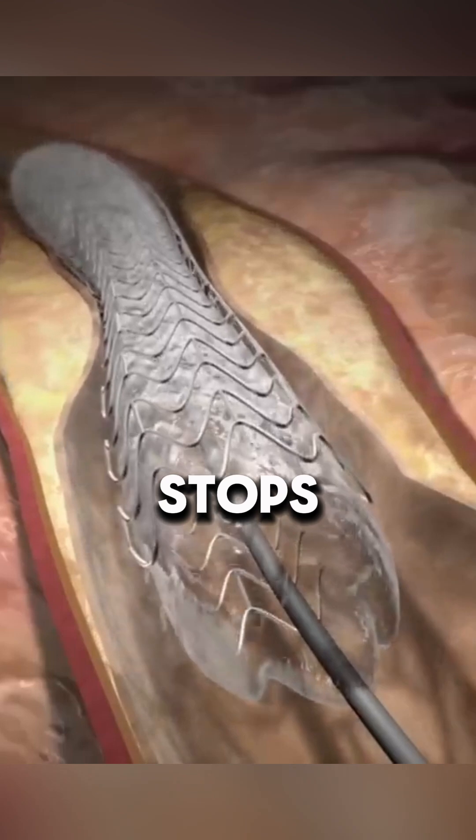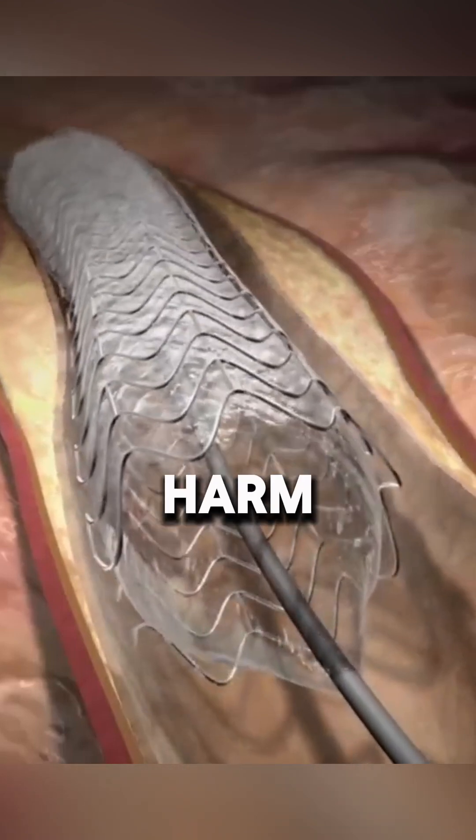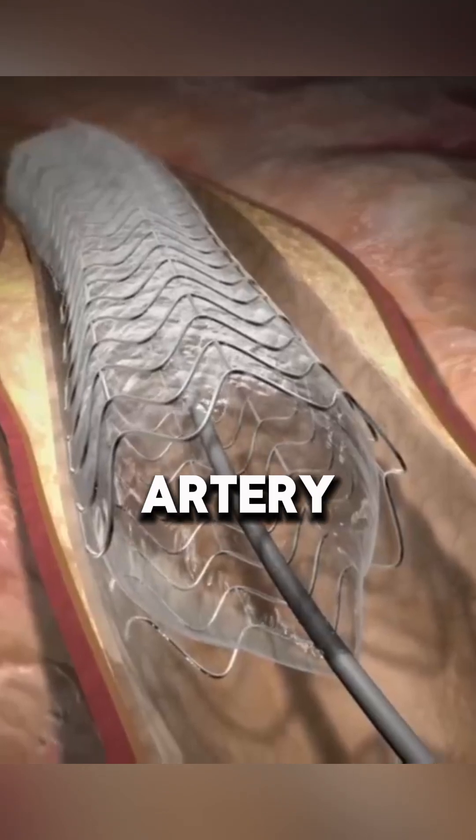While the balloon is inflated, blood flow temporarily stops, which causes mild chest pain, but it is not long enough to harm the heart. The stent helps keep the artery open.